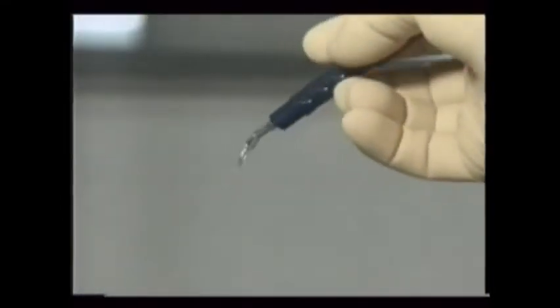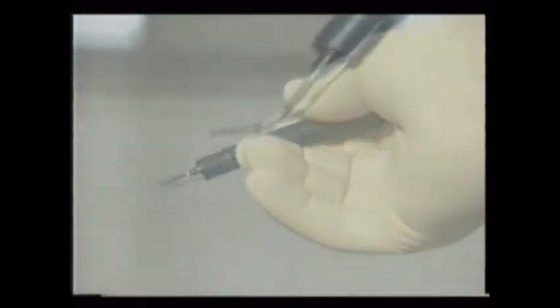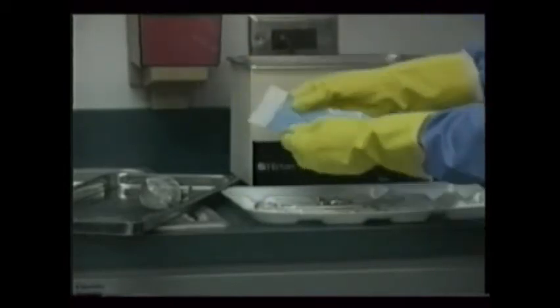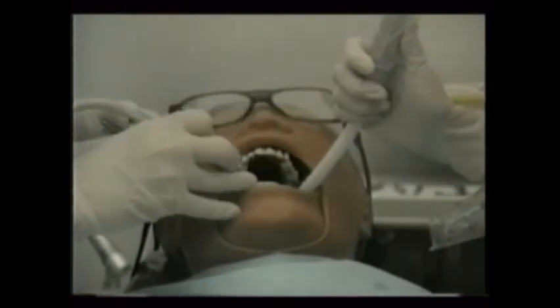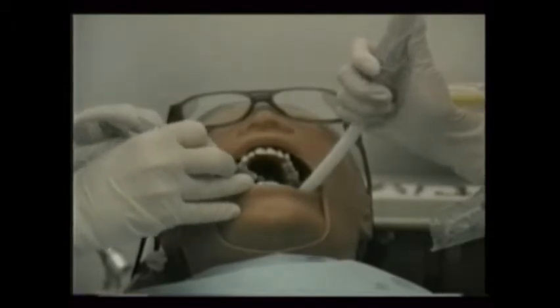Air-driven ultrasonic tips are used in conjunction with hand scalers. Using sound waves higher than 25,000 cycles per second, their tips effectively dislodge gross dental deposits. Water cools and irrigates the area during their use. Ultrasonic scalers are sterilized between uses in the same manner that dental handpieces are. The potential for aerosol generation is very great, so high volume evacuation is needed when using ultrasonic scaling.